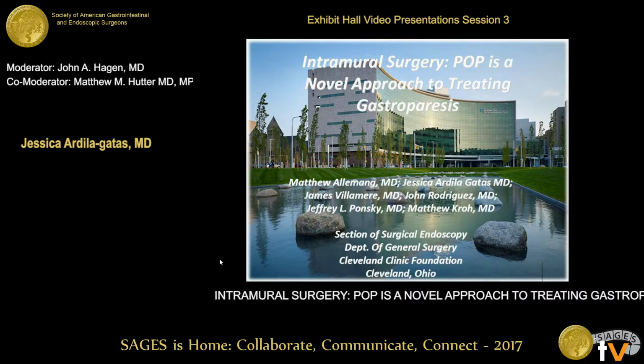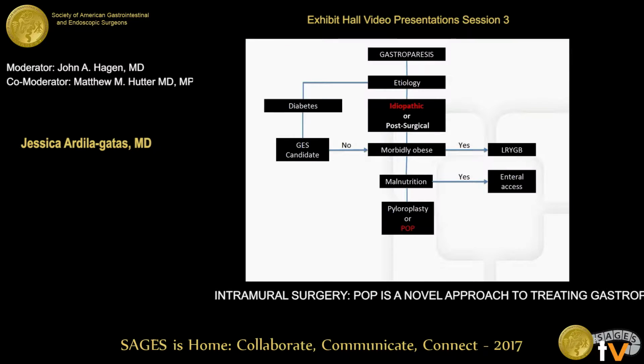I'm Jessica Ardila. I'm one of the PGY3 general surgery residents at the Cleveland Clinic. Peroral pyloromyotomy is one of the endoscopic and surgical treatments to gastroparesis refractory to medical therapy.